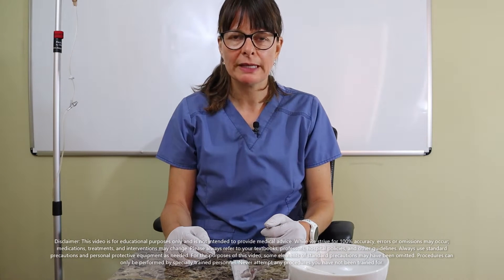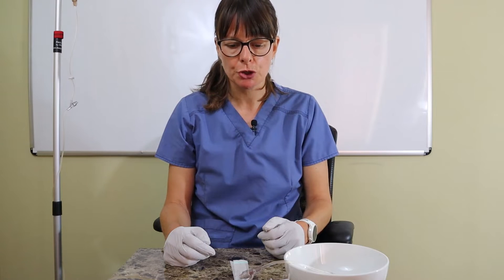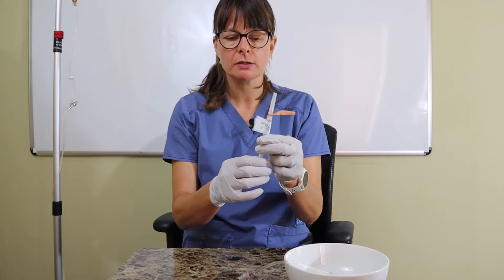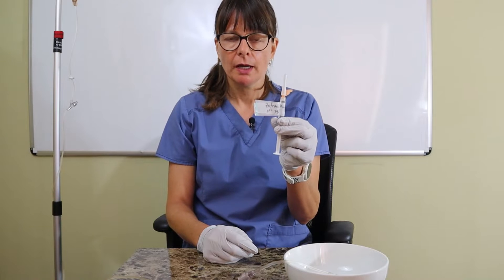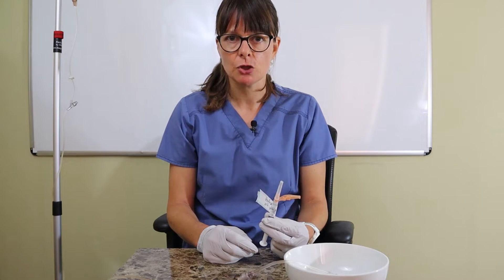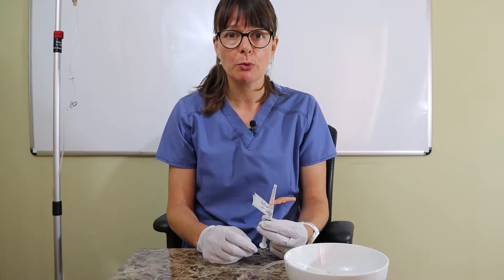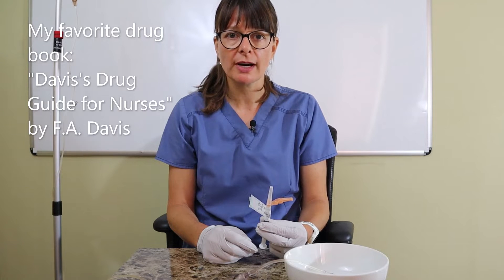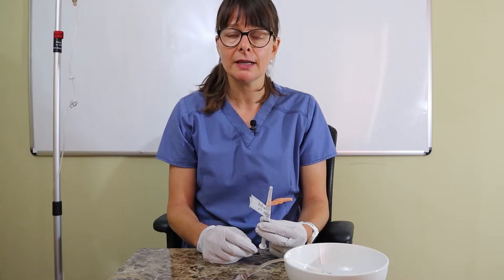Welcome to Nursing School Explained, and this video on how to administer a medication by IV push. I have already prepared my medication here. In this case, it's Zofran 4 milligram, which is an anti-emetic. In order to find out how fast you can administer this medication safely, always refer to your medication handbook or drug book. My favorite is always the Davis Drug Guide for Nurses, which has the information very easily accessible.